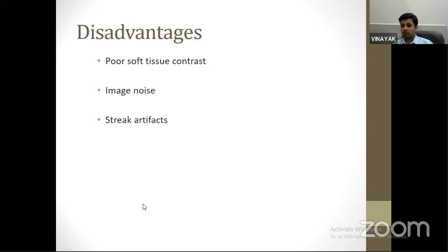If you want to check for malignancy, right? Always a CT scan is better for malignancy because CBCT will never give you the soft tissue extent of the lesion. And oral squamous cell carcinomas, most commonly they begin in the soft tissue and then they incorporate the bone. Yes, there are intraosseous ones also, but generally it is first soft tissue. So if you are suspecting anything in the lip, anything in the tongue, like a lymphangioma, hemangioma, or any tumor, or any lesion which has a soft tissue extent, then you don't go for a CBCT scan, you go for a CT scan.